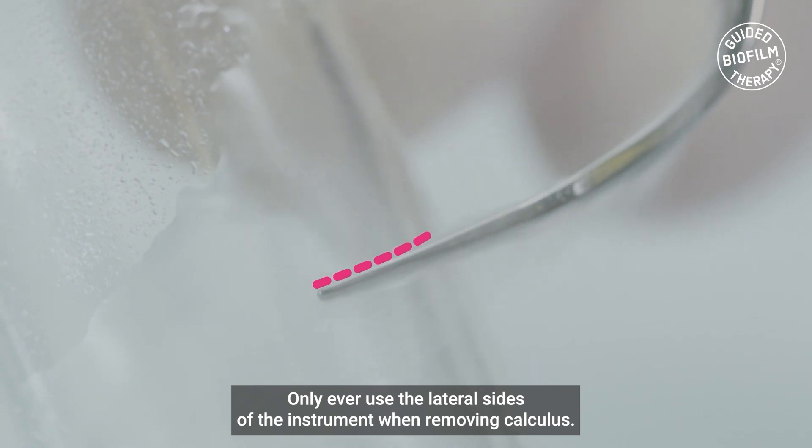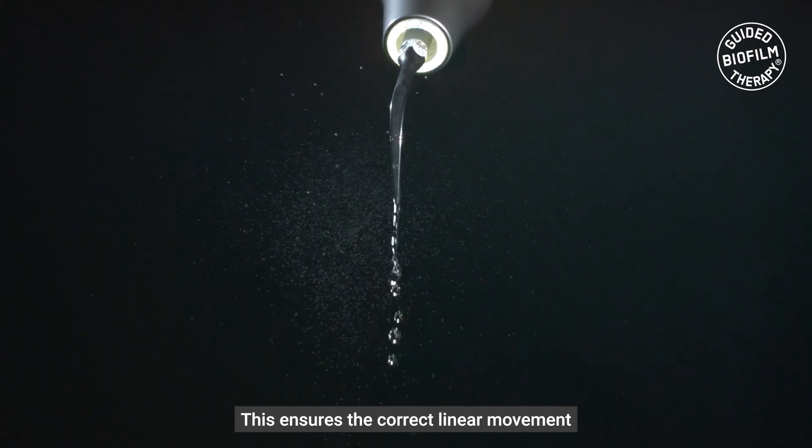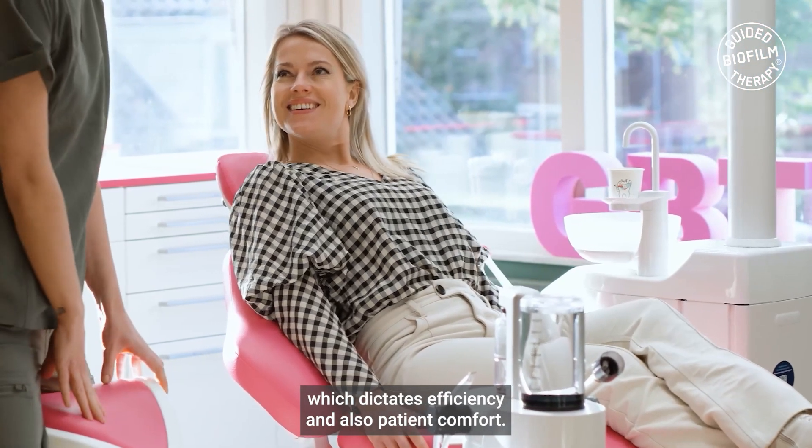Only ever use the lateral sides of the instrument when removing calculus. This ensures the correct linear movement which dictates efficiency and also patient comfort.